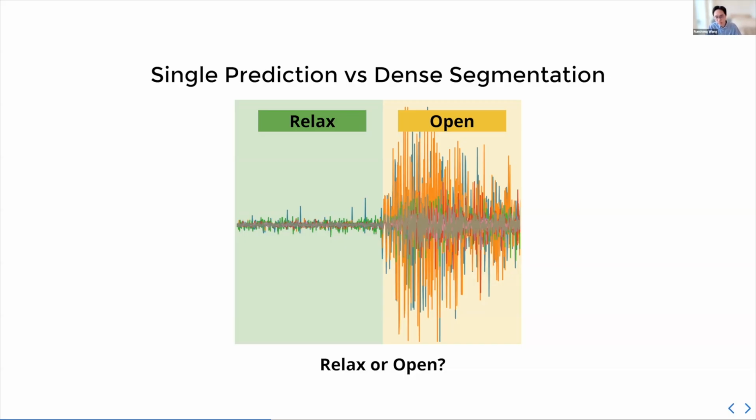But all of these cause ambiguity and impreciseness, but also they potentially cause latency, which is what we care a lot about when we want to design human-robot interactions, and when we design wearable robotics. It has to be responsive, it has to be fast. So this will work, but it's not ideal.